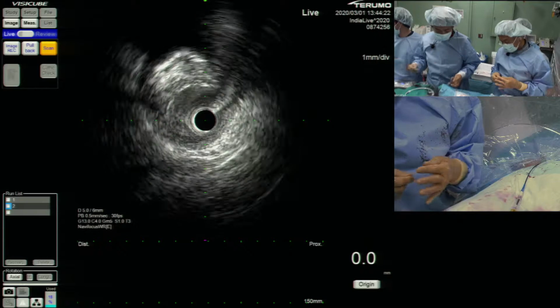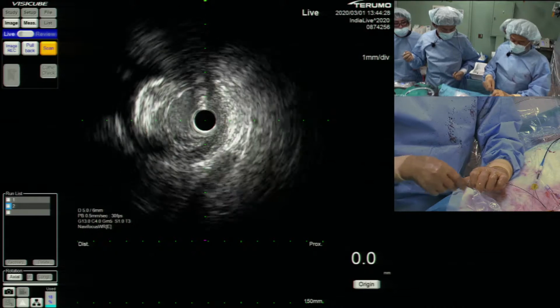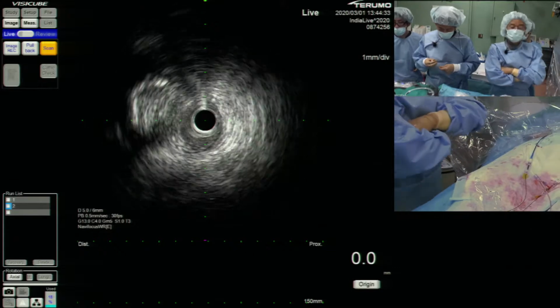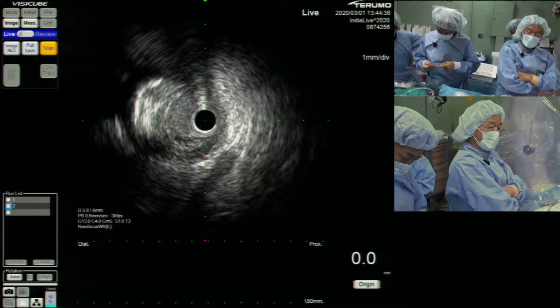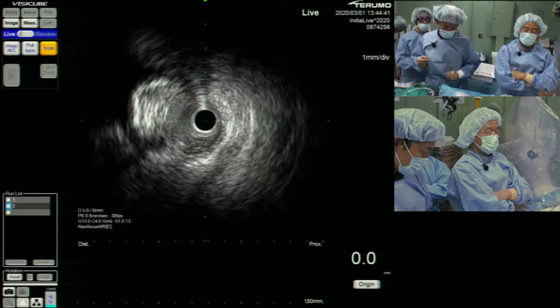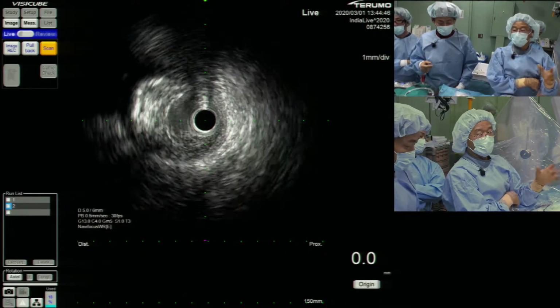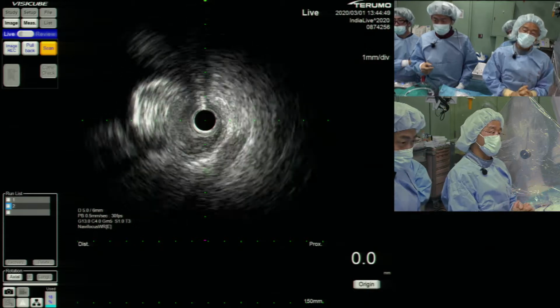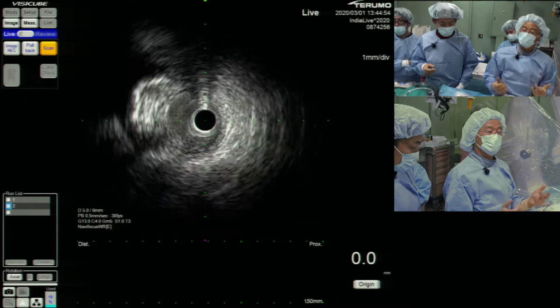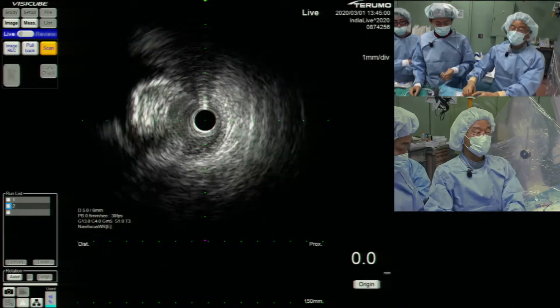Do you think this working projection is okay in the right anterior, please? Or you could go to the earlier view, where you might still see at least the side branch angulation, because here we are seeing them parallel. This patient has a transverse position of his heart, so we need a very deep caudal view to see the ostium, or to see the proximal part of the LAD. The deep cranial view is impossible, so we can't see the ostium of the CTO clearly.